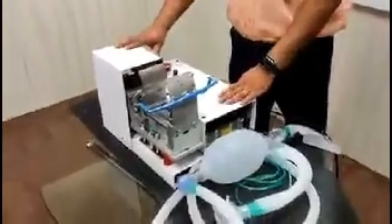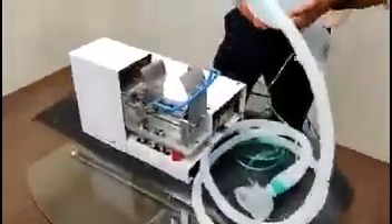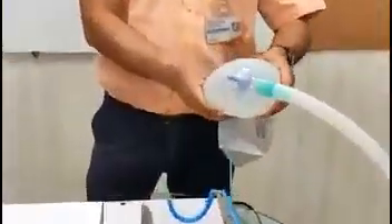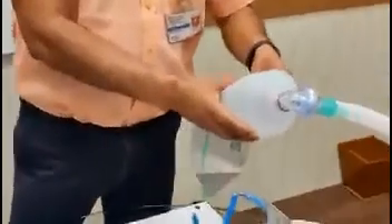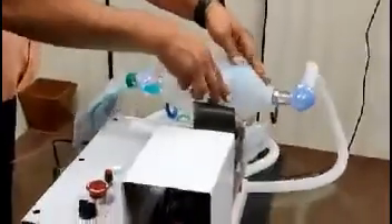We have developed a mechanical device for operating the BVM bag. The BVM bag is currently being used by medical practitioners in emergencies, operated manually. Since the pressing is done manually, it cannot be sustained for longer durations, and in current circumstances, distancing from the patient is very necessary. So we have motorized the pressing operation with all the necessary controls.